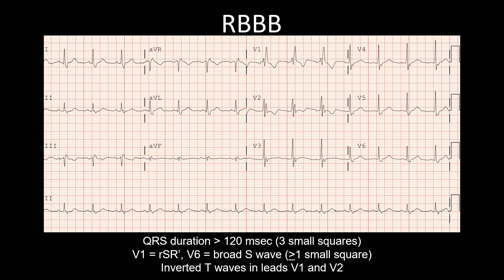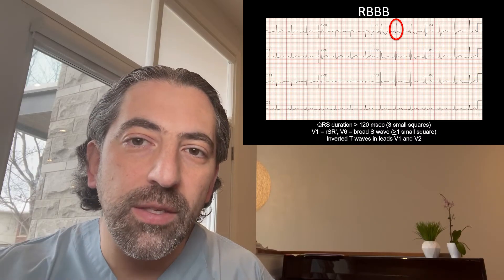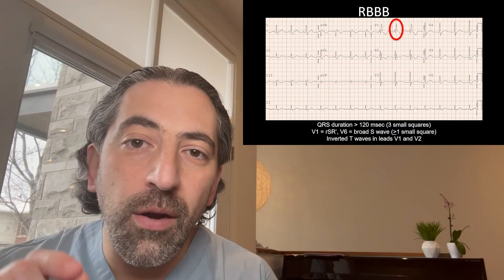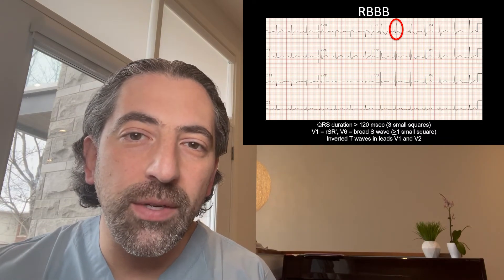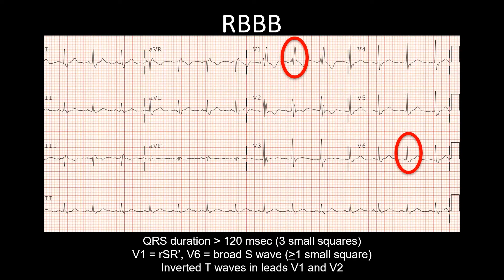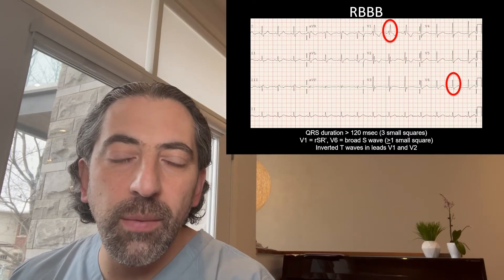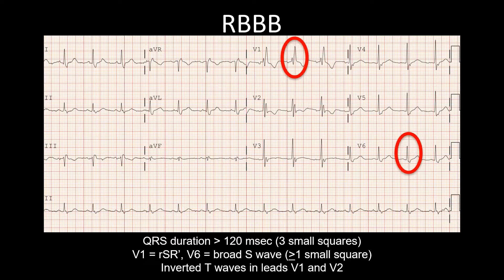This creates a large broad R prime in lead V1 and a large broad s wave in lead V6, and overall a wider QRS complex. This is a typical right bundle branch block ECG. In lead V1 you see an RSR prime complex — a small r, an s wave, and a large broad R prime generated by slow depolarization of the right ventricle. In V6 you see a terminal broad s wave, also generated by slow depolarization of the right ventricle.